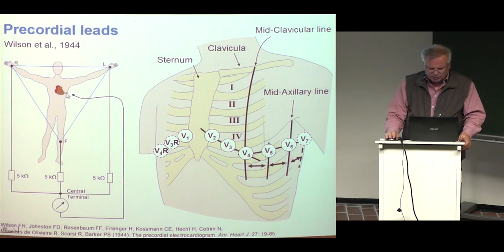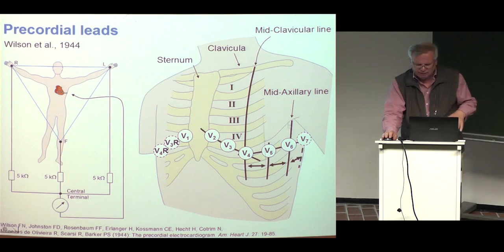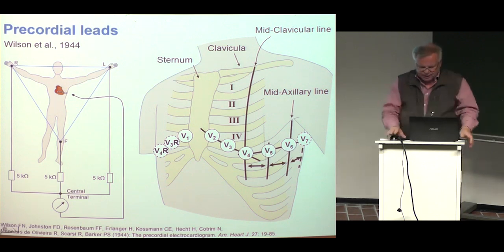These precordial leads or recording points, of course, are standardized, because they are used in the standard 12-lead ECG. In the fourth intercostal space between the ribs, on both sides of the sternum are V1 and V2. V4 is in the fifth intercostal space at the mid-clavicular line, and V6 is on the same horizontal level on the mid-axillary line. And correspondingly, V3 and V5 are in the middle of the corresponding electrodes. V7 may also be used.